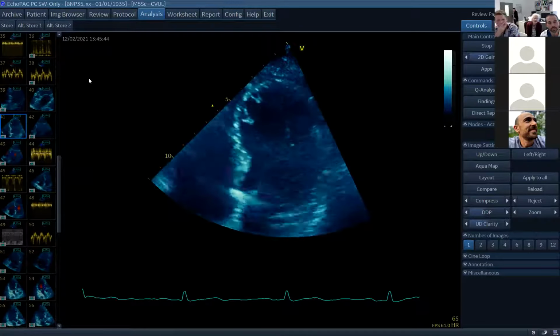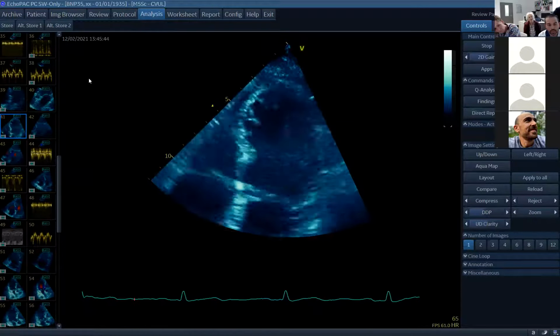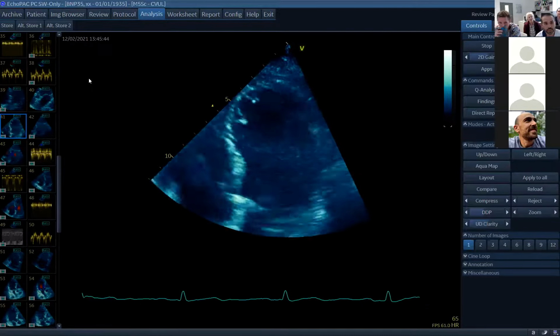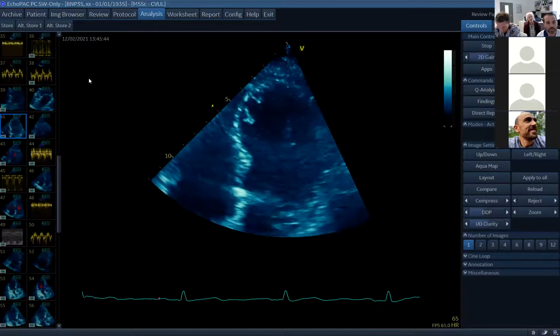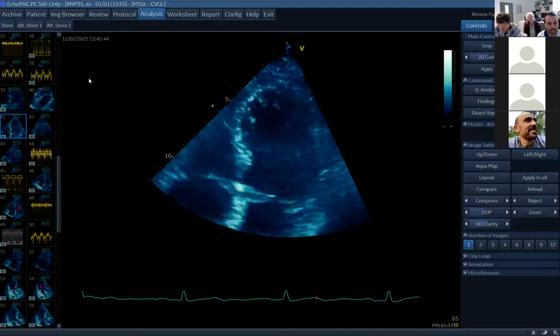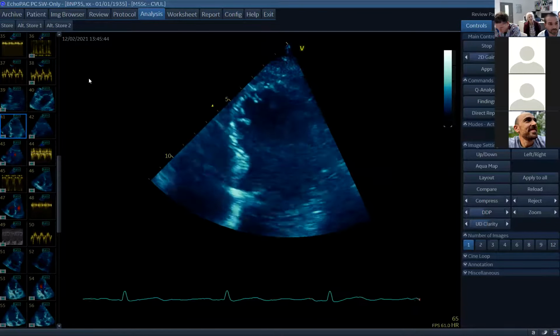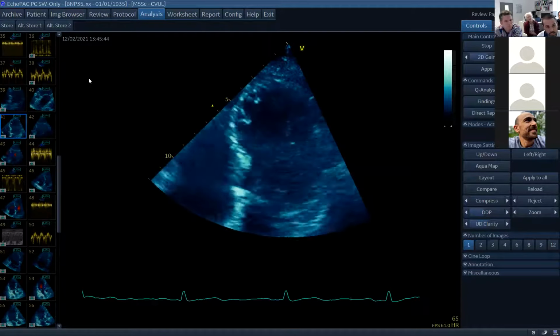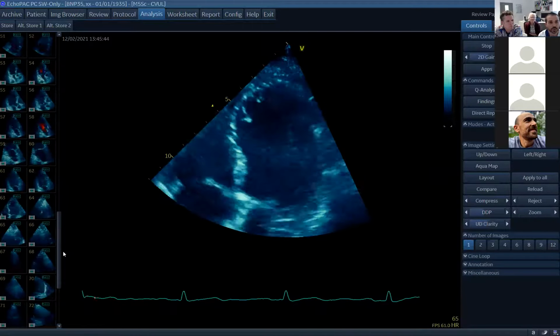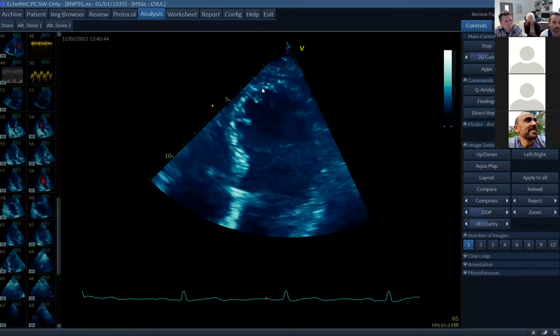So I've now come around to an apical 4-chamber view. Again, the most striking feature is the appearance of reduced LV function in light of being on inotropic support. His LV does not look to be dilated. I don't know his underlying cardiac history. His RV looks like it's functioning normally. His tricuspid valve looks like it's closing properly. I can't see any pericardial effusion or clear identifiable cause for his increasing need of inotropes.